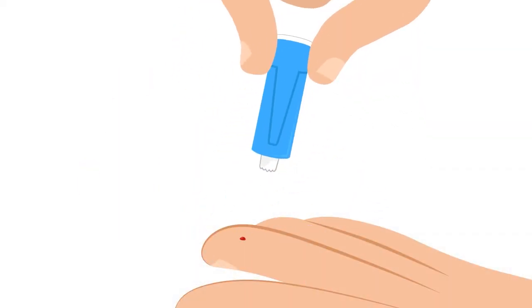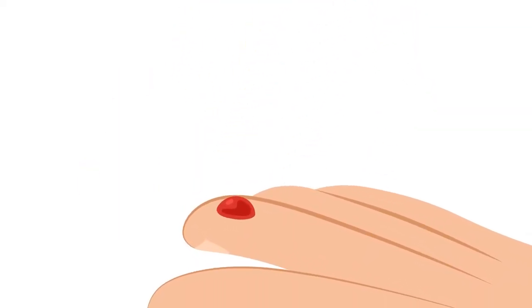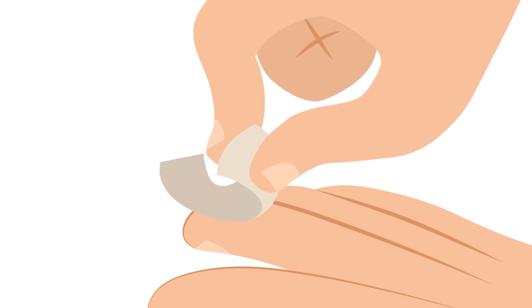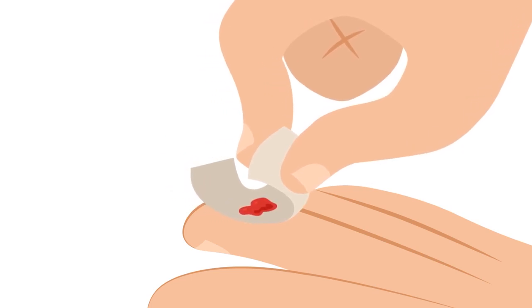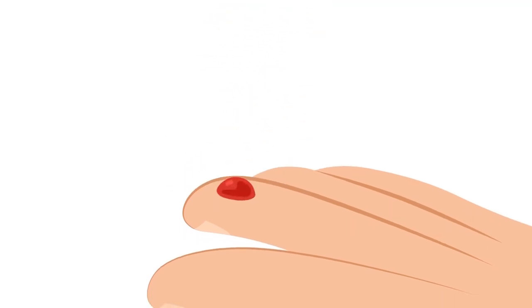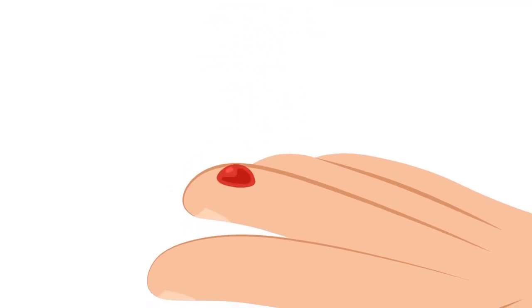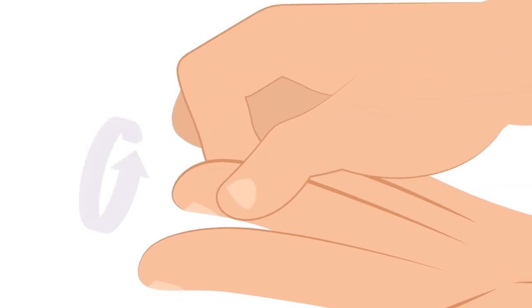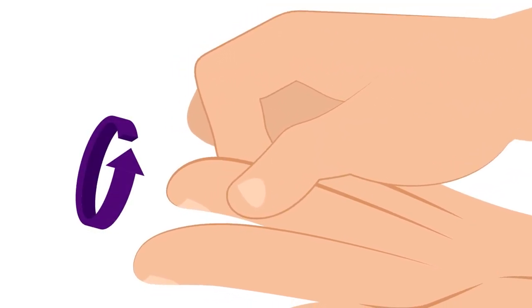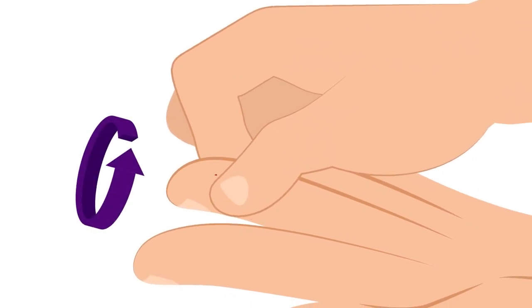Wipe away the first drop of blood with the gauze. Allow a second drop of blood to form, as the second drop provides a better sample. If no blood appears, massage your finger to help with blood flow or try a different fingertip.